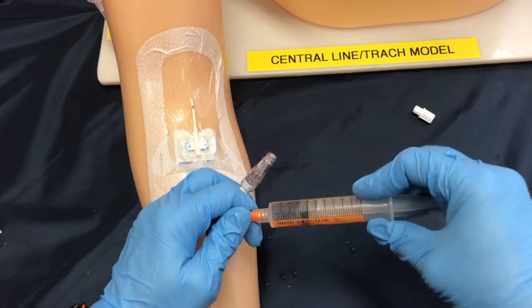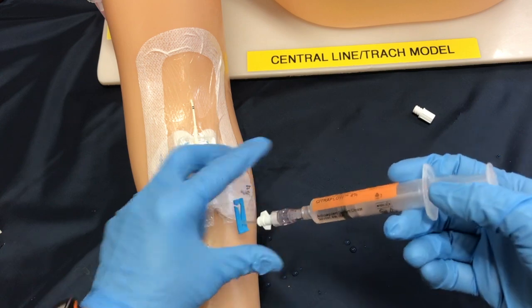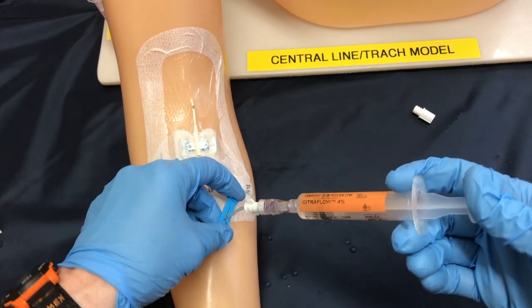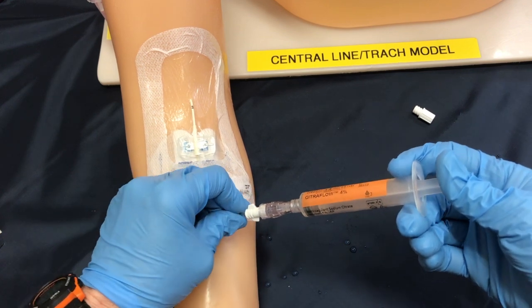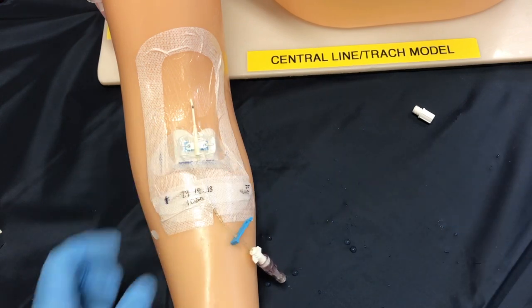Removing the cap and keeping sterile to sterile, we will insert and turn and we're ready to instill. Unlock your line and you can start to infuse your sodium citrate or heparin, preparing to lock off that line in the last one mil of infusion. Remove your sodium citrate and you are complete.